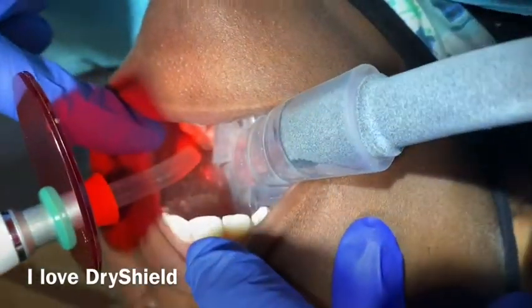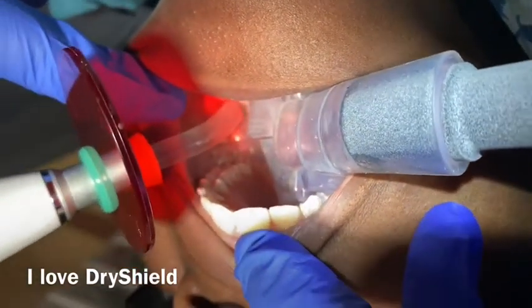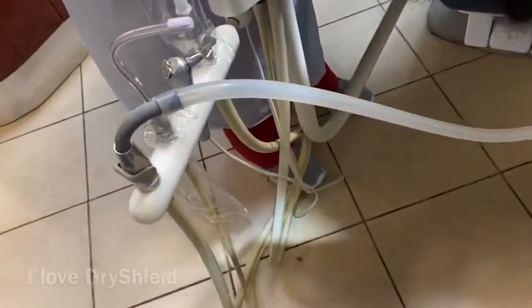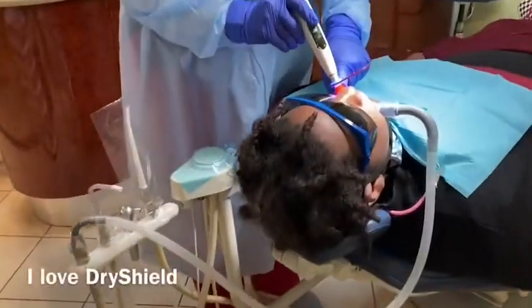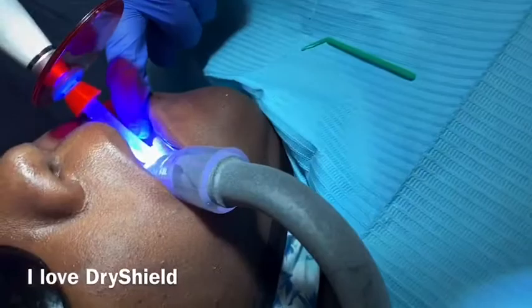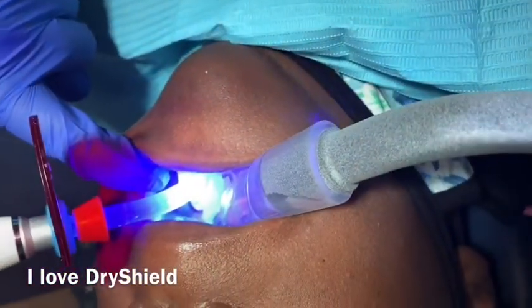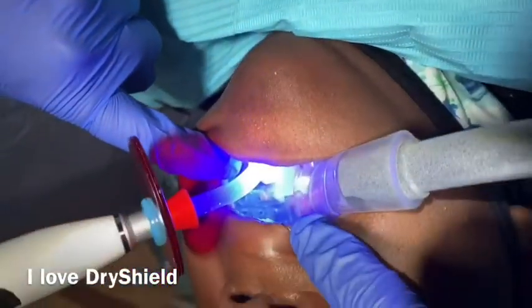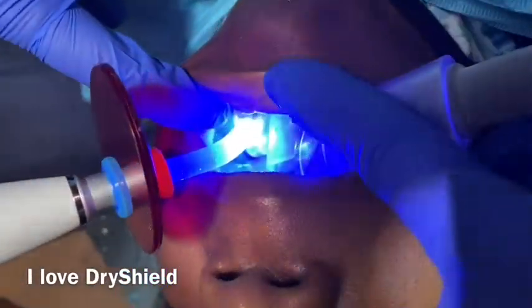I highly recommend DryShield for occasions where you don't have a dental assistant, or even if you do have the systems. It can help you retract the lip and isolate the tongue — DryShield will do all of that for you. It's a great investment for your office.